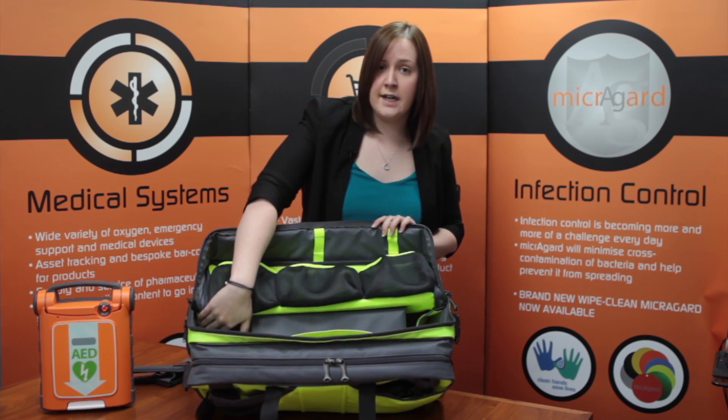In the bottom of this section there is a secure and protected tunnel for a D-sized oxygen cylinder with an external access point.